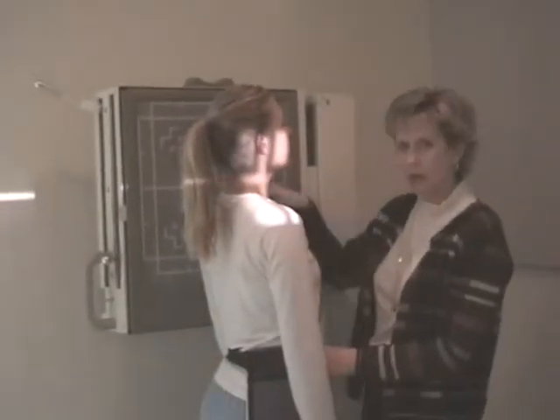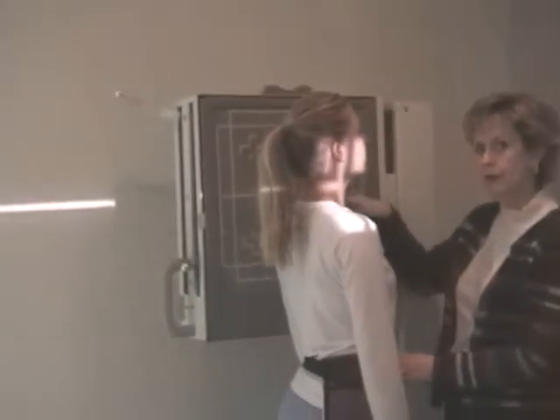Step forward, please. And the last thing I want you to do, if the camera can focus on the board here, is to look at the amount of collimation and the shadow of her neck. See the shadow of her neck right down the center of the board? Okay, does that help? This is going to let me know that I can tighten up that collimation a little bit more. It will also let me know, Kristen, would you step back?